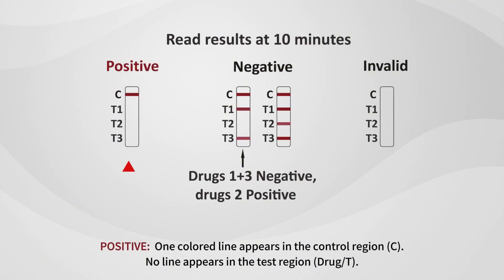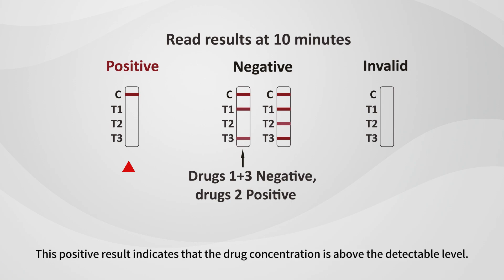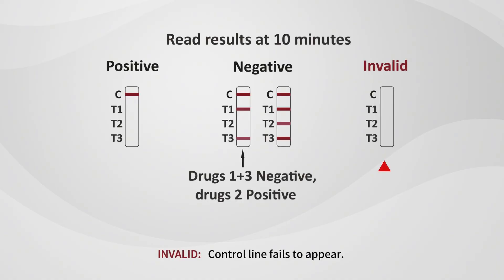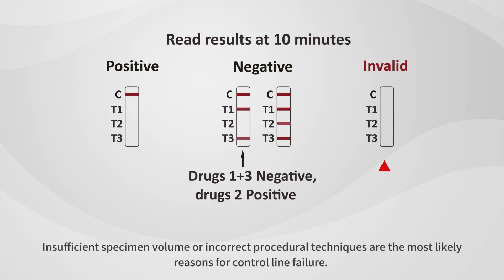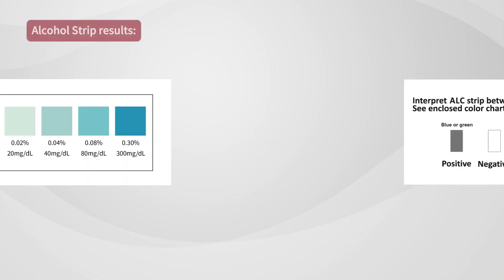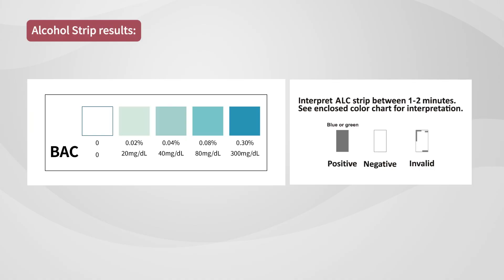For a positive result, one colored line appears in the control region C. No line appears in the test region T. This positive result indicates that the drug concentration is above the detectable level. For an invalid result, the control line fails to appear. Insufficient specimen volume or incorrect procedural techniques are the most likely reasons for control line failure.